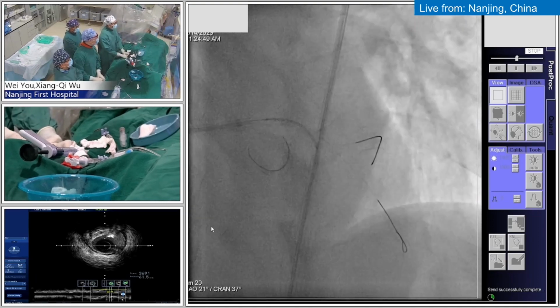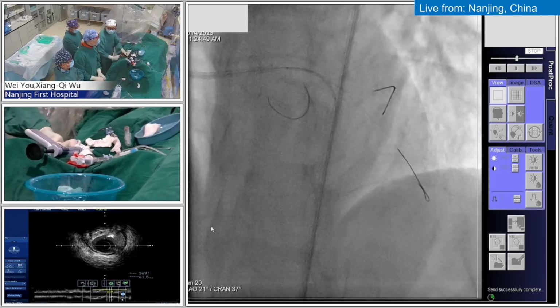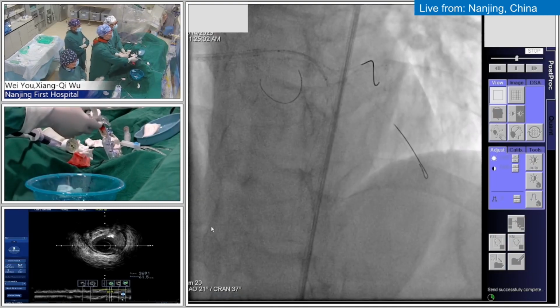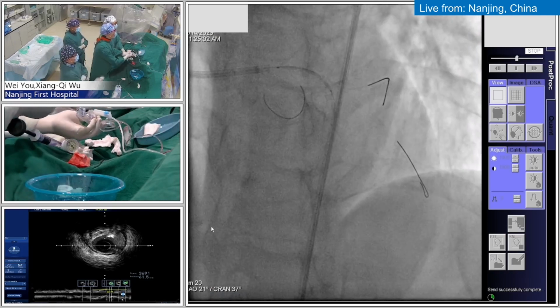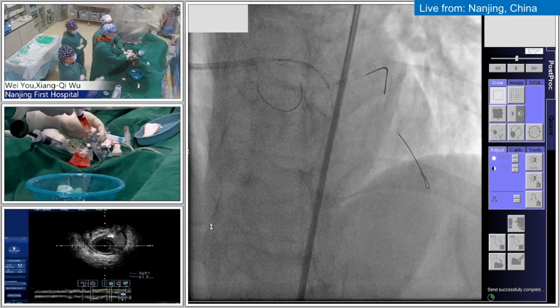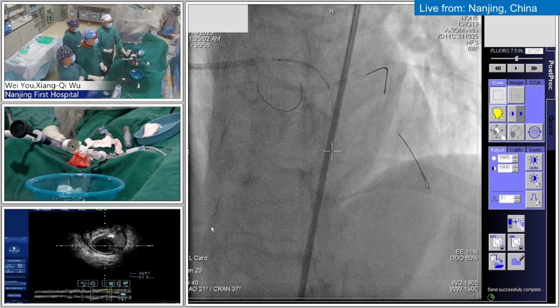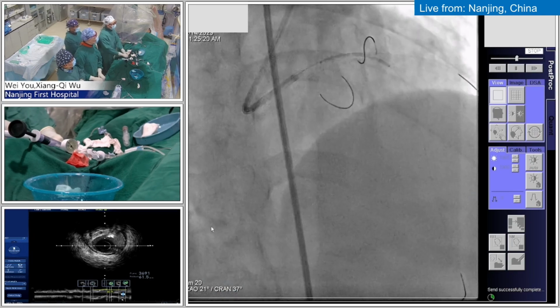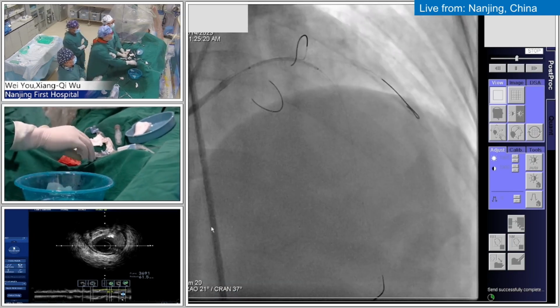So this is the 30 by the length, 29 or 26? The Chinese domestic stent. Okay. Test please. I just want to cover the whole left main stem. Okay. And I think you have IVUS, yeah. Routinely we use the RAO cranial or LAO cranial, the two projections, to confirm our stent position. Okay, good. Okay, test. Okay, yes, test please.